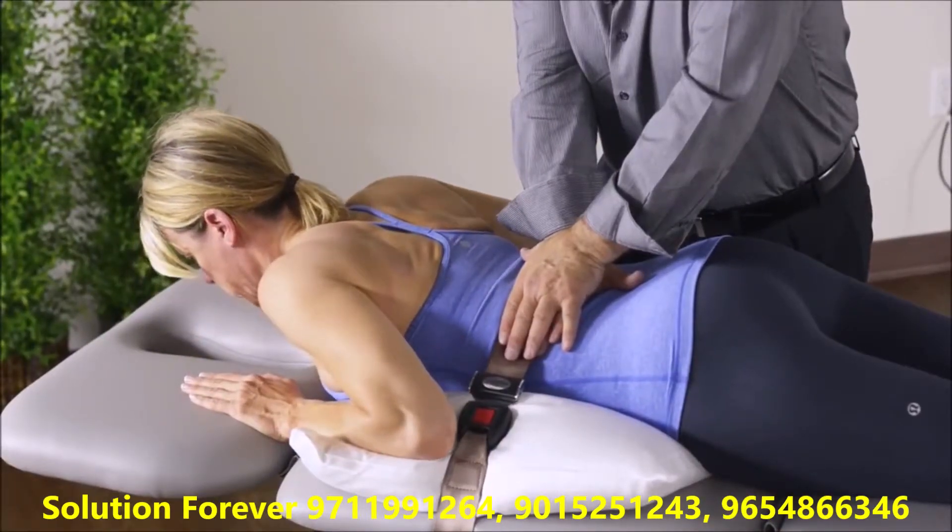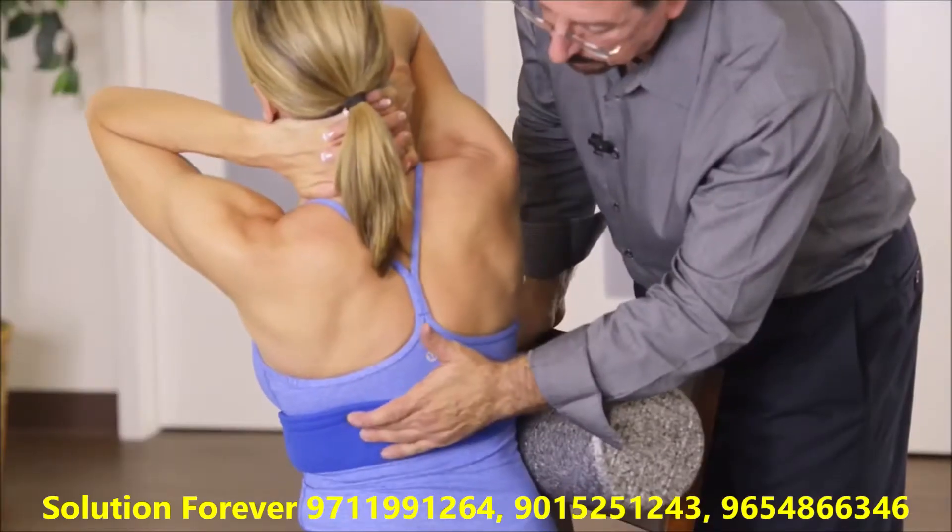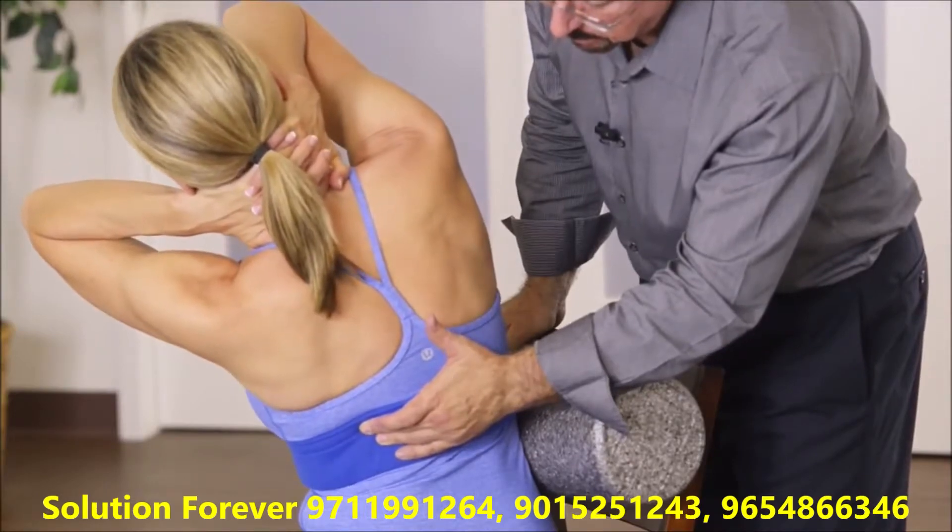The belting techniques can also be used as an artificial lock to stabilize a segment while the therapist mobilizes another segment to get the best clinical outcome.